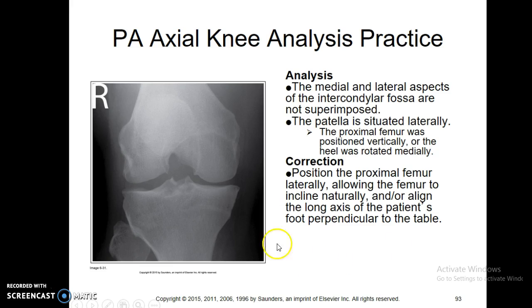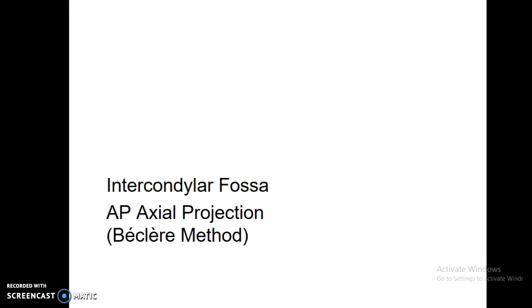This one, rotation. Okay, you can't see the nice clear notch view that you see on this one. You can see the patella is shifted off to the side as well. Probably something you should save until you do your next Holmblad method on that.